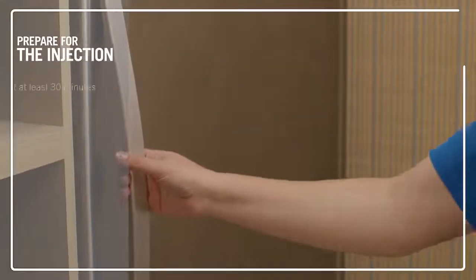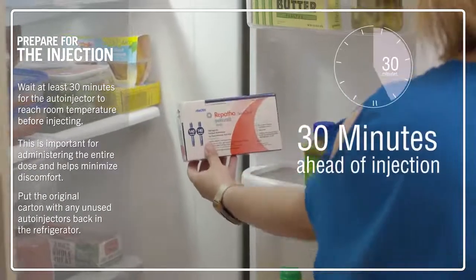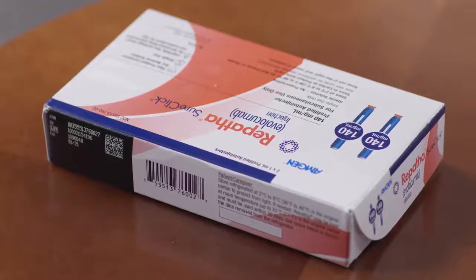When you receive your Repatha, you should put it in the refrigerator right away. When you're ready for your injection, you need to remove your Repatha SureClick auto-injector for at least 30 minutes. This is important for administering the entire dose and helps minimize discomfort. Some people like to use the timer on their phone, but you can actually leave it out for up to 30 days. I like to take mine out of the refrigerator the night before so that it's ready and waiting for me first thing in the morning.